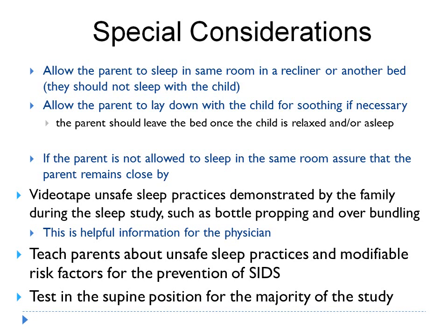Some other special considerations in regard to pediatric polysomnogram: allow the patient or the parent to sleep in the same room, maybe in a recliner or another bed, but not in bed with the child.